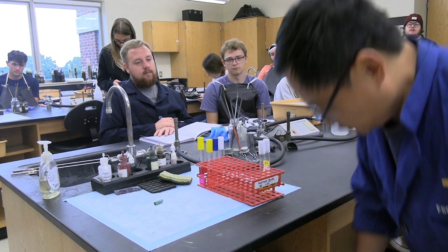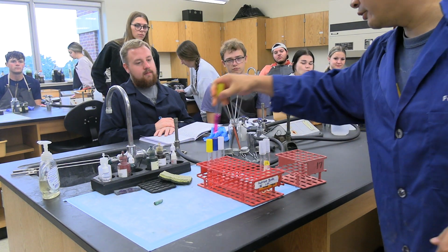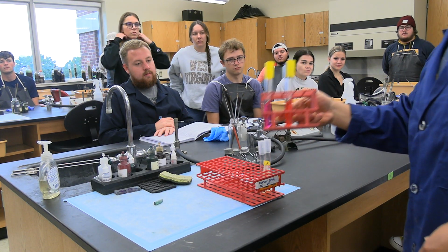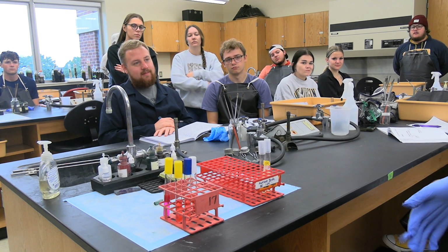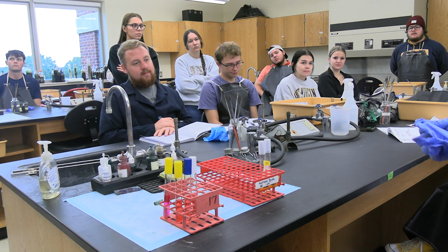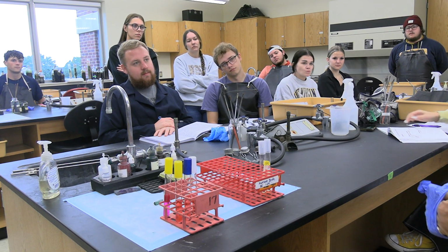First of all, using your personal tray, go there to get these tubes. You're going to have an order like this. Of course wear gloves, do not use your bare hands. That's 4 tubes. If you remember, that's good. If you don't remember, please write in your notebook what these are. It's very important, otherwise you're going to mess it up.